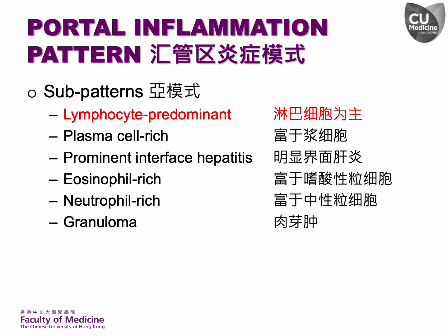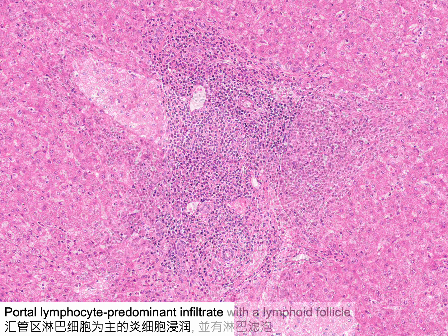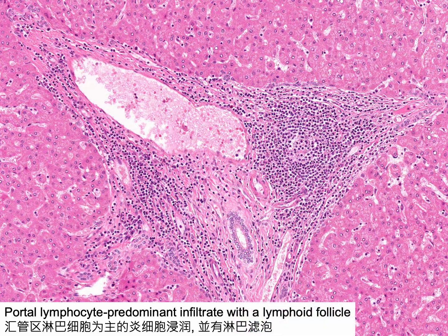The first sub-pattern is lymphocyte predominant portal inflammation. This portal tract is expanded by a moderate amount of inflammation, predominantly composed of lymphocytes. This portal tract is expanded by a moderate inflammatory infiltrate primarily composed of lymphocytes, along with a reactive lymphoid follicle.